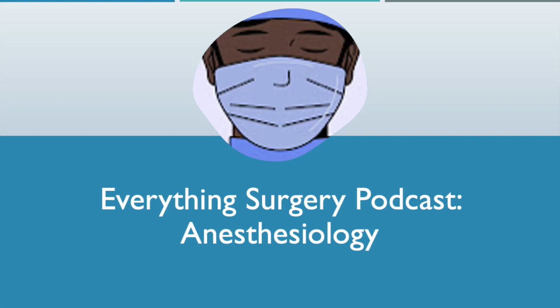Systematic approach to interpreting an arterial blood gas. Welcome to this episode of the Everything Surgery podcast, where we delve into the essential skills every clinician needs. Today, we will walk through a structured and methodical approach to interpreting an arterial blood gas. This 7-step strategy ensures accuracy and clarity, minimizing errors and maximizing patient safety. Remember, always begin by confirming both the fraction of inspired oxygen and the clinical scenario of the patient.